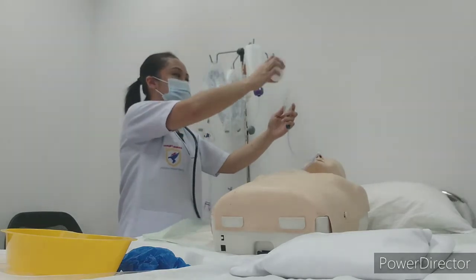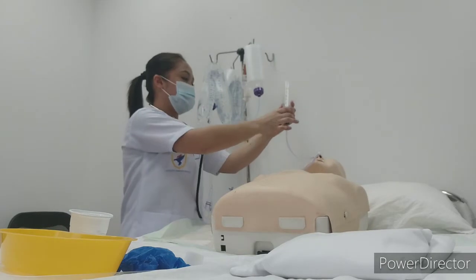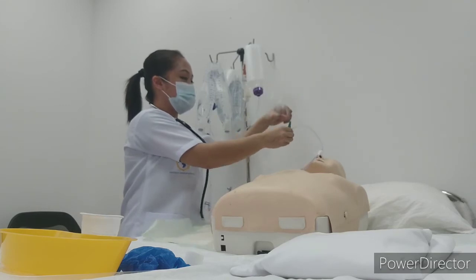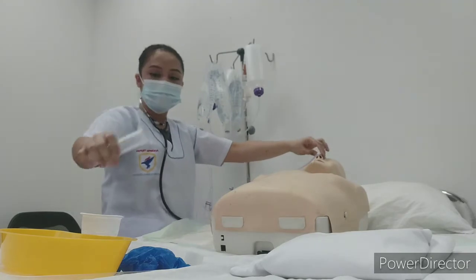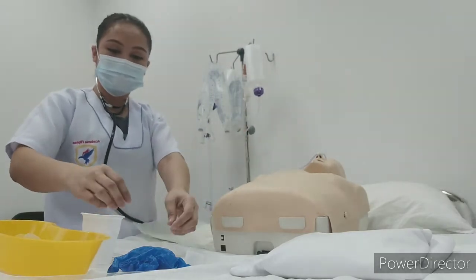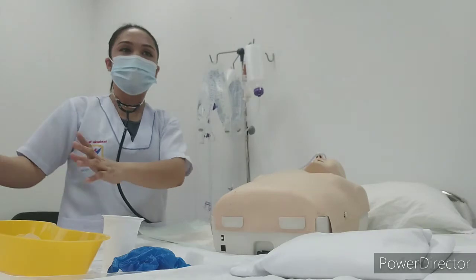So again, 30 ml of water. So now it's okay. We will disconnect this one, pinch, disconnect, and then close. Okay. And then set aside. And then the materials, you need to wash the kidney basin, the aseptic syringe, and the remaining lubricant gel you can also use after, and then the remaining you can throw in the medical waste.